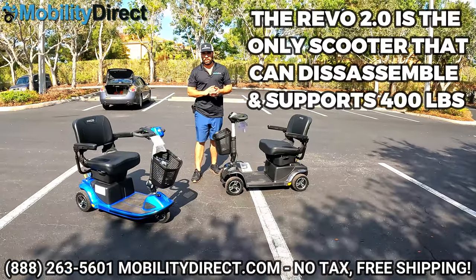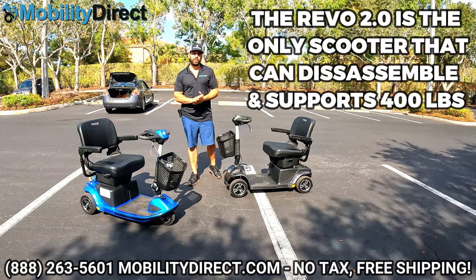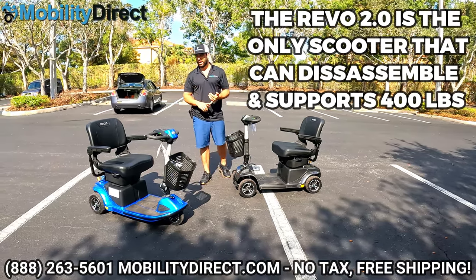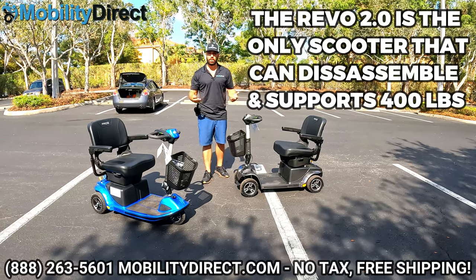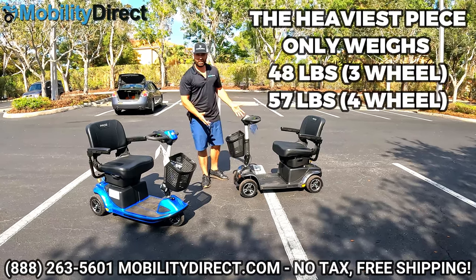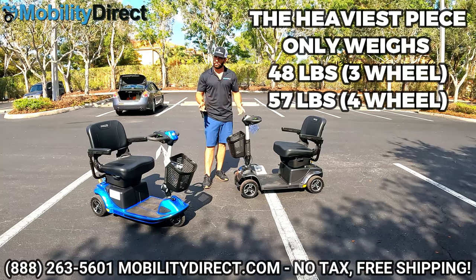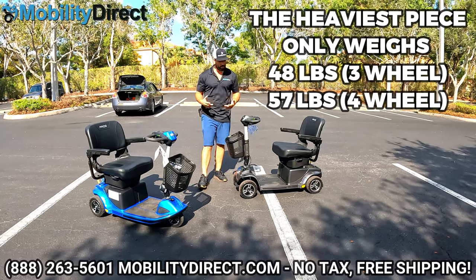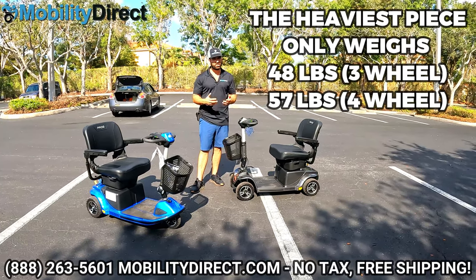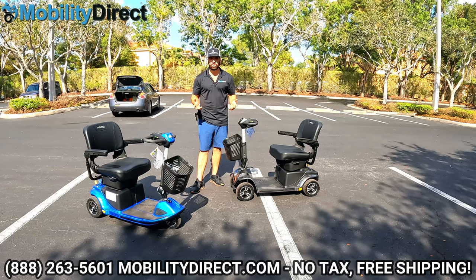What makes this model special is that both have a 400-pound weight capacity. No other scooter in its class has a 400-pound weight capacity and the ability to come apart. It basically breaks down into six lightweight pieces — very manageable size and weight — so you can put it in the trunk of almost any car, especially a van or an SUV. So it's easy to travel with.